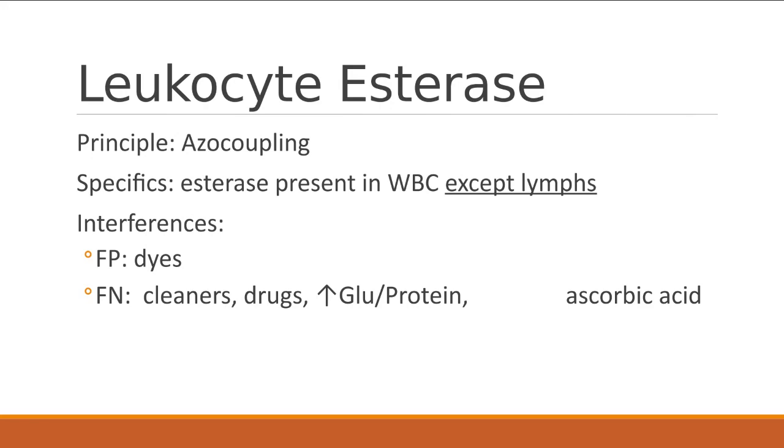Okay, so white cells, they're going to indicate inflammation. And typically, you're going to see them in most of your renal diseases. When they lyse, they can release esterase. They would lyse in a diluted urine, because remember, urine is mostly water. If you have increased bacteria, increased pH or heat, any of those type of things, or centrifuging it too hard, those things can cause your white blood cells to lyse. And then that would cause problems when you look at your microscopic.